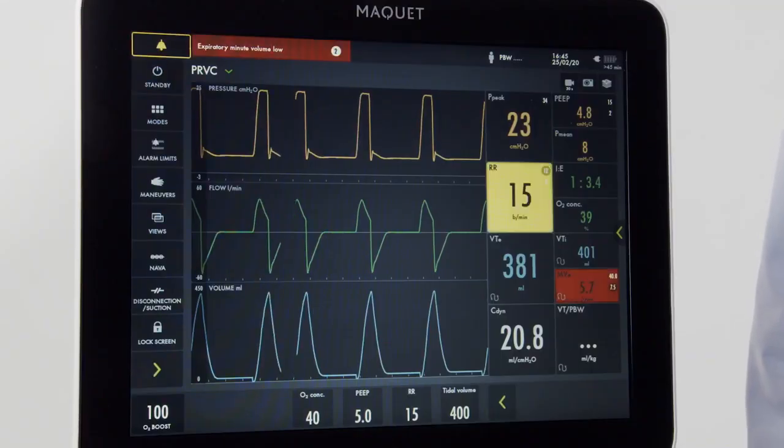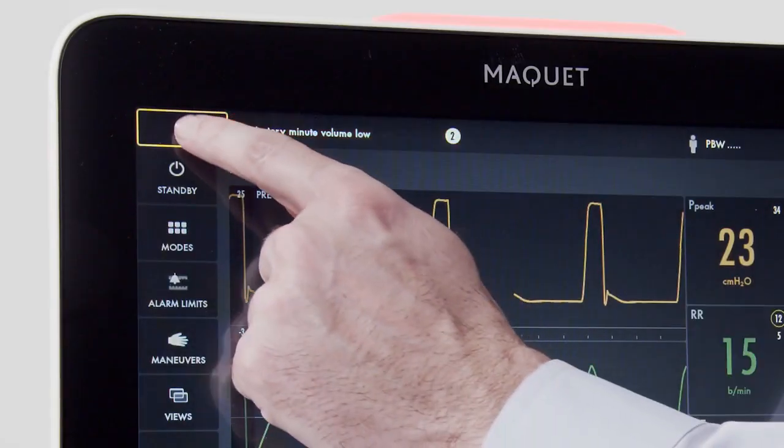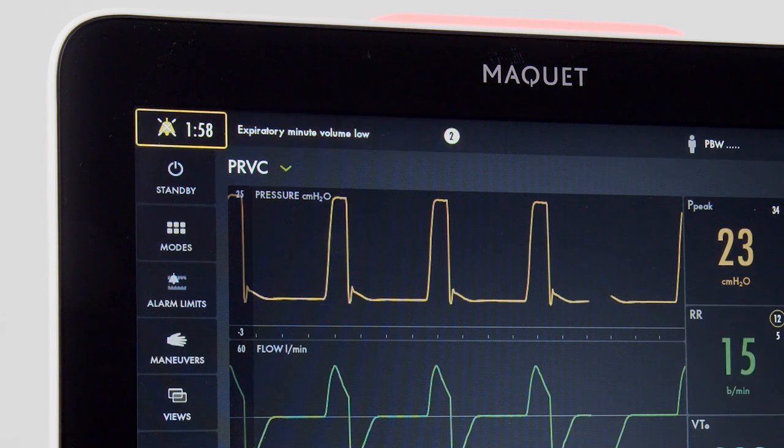To silence an alarm, identify the alarm silence button on the top left of the screen — notice the bell. Once pressed, we will have two minutes of silence.